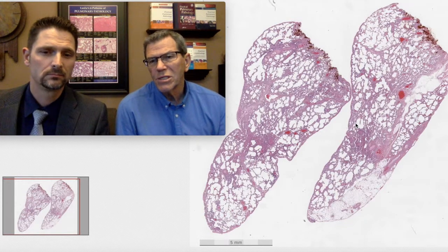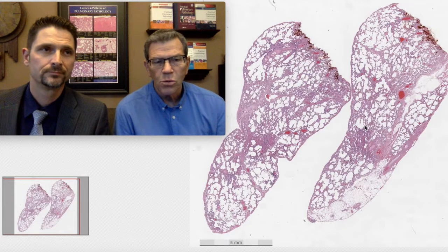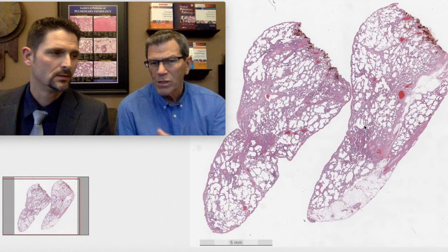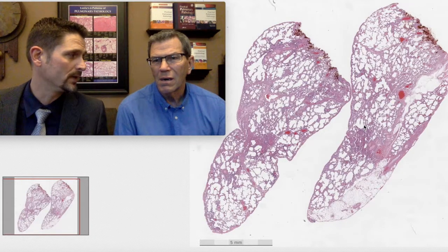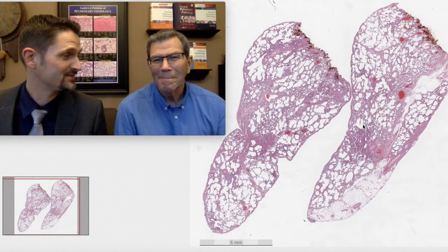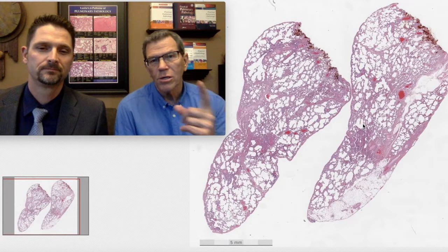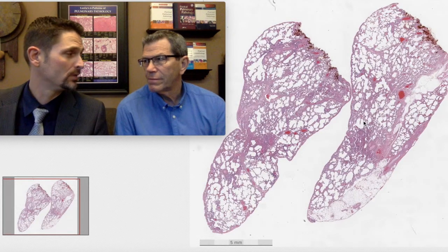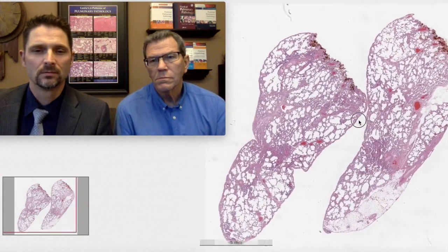A lot of people will say patchy equals UIP. Should we be thinking about UIP when we look at this biopsy at 2X? No — UIP is a pink disease, and we're in the blue disease category. So even though it's patchy, it's not UIP. Too inflammatory for UIP. Too blue.